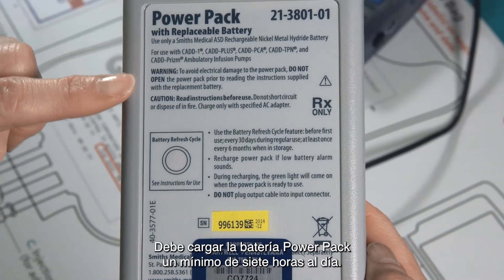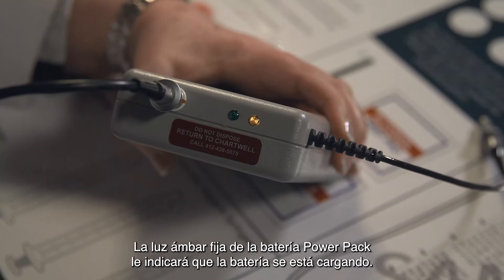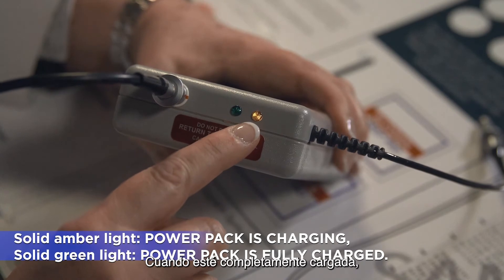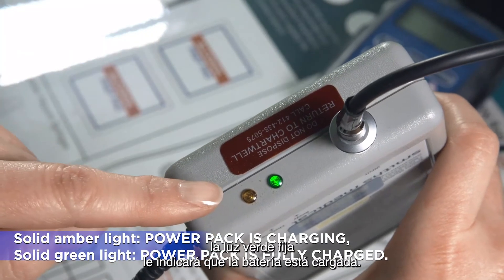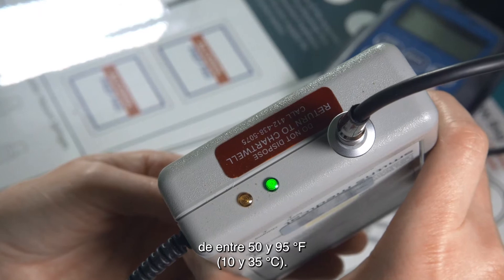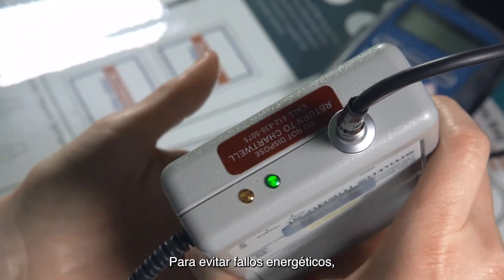Your power pack should charge a minimum of 7 hours each day. The solid amber light on the power pack will indicate the battery is charging. Once fully charged, the solid green light will indicate the power pack is ready to be used. The battery should be used, charged, and stored in the temperature range of 50 degrees Fahrenheit to 95 degrees Fahrenheit to prevent loss of power.